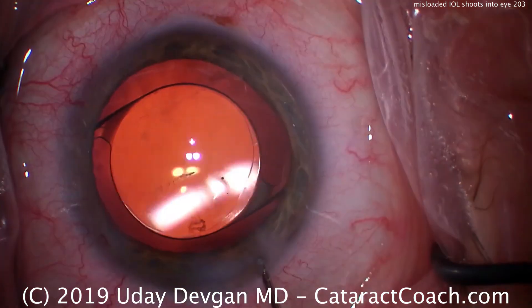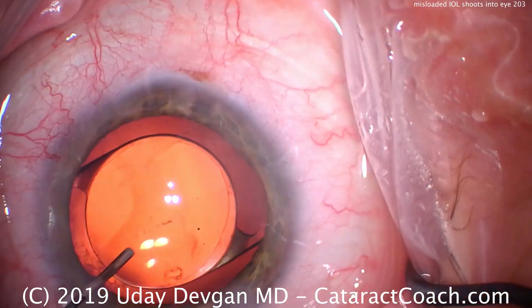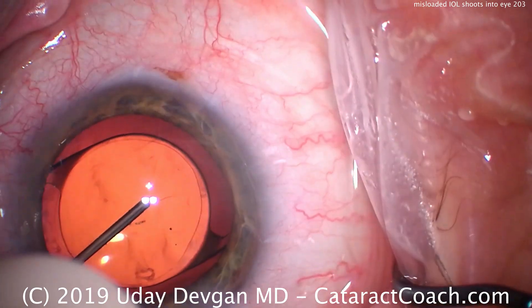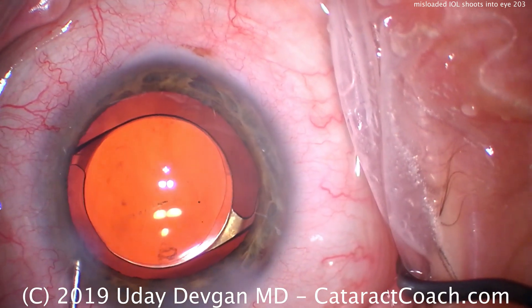So here's sealing the incision. Looking carefully — you'll also notice that there's a small little piece of lens cortex that's present. So removing any viscoelastic that remains, the capsulorrhexis looks good. It overlaps the optic 360. We're happy about that. We're sealing up the incision.